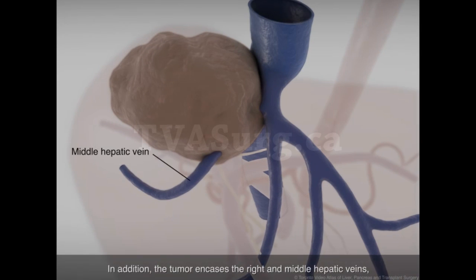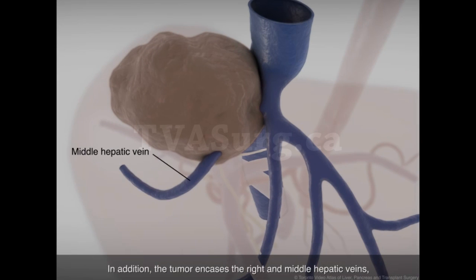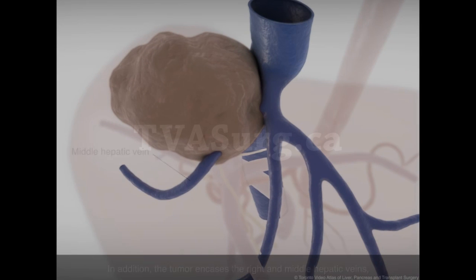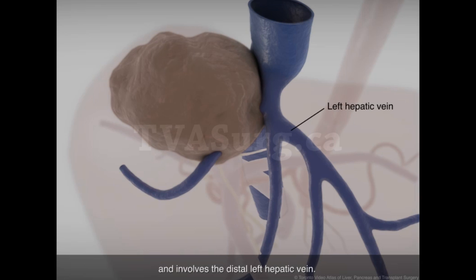In addition, the tumor encases the right and middle hepatic veins, and involves the distal left hepatic vein.